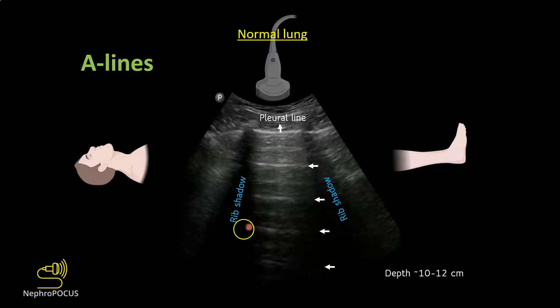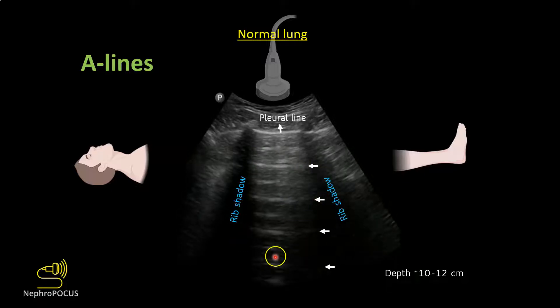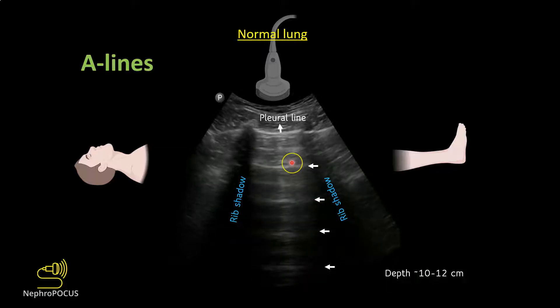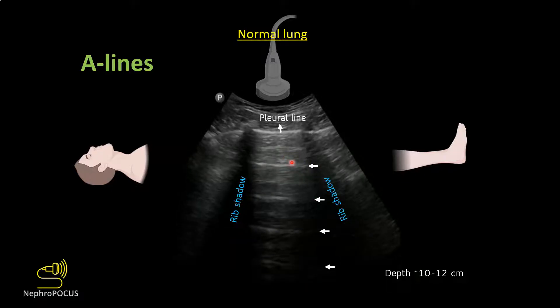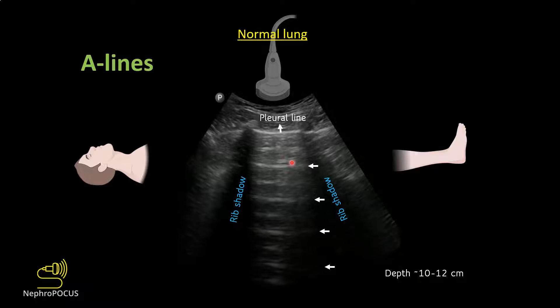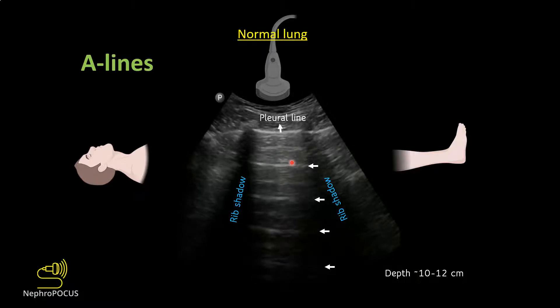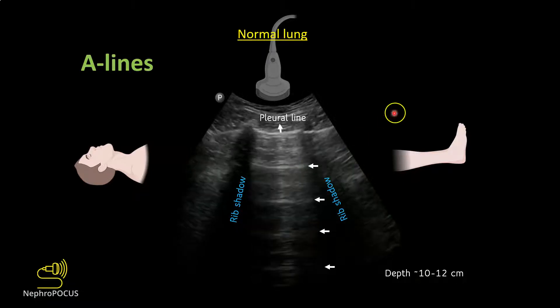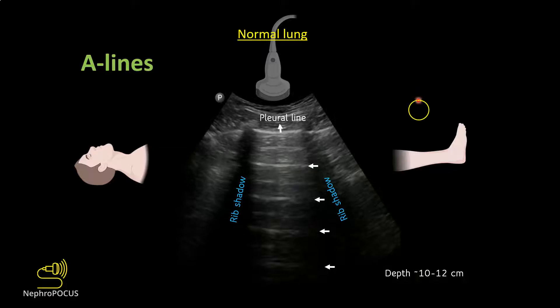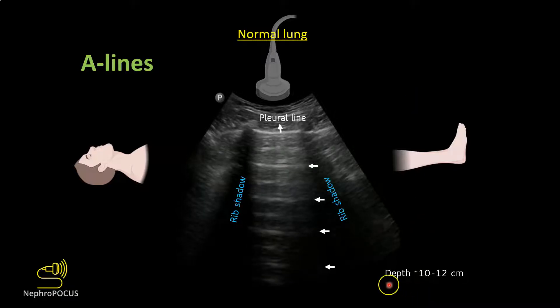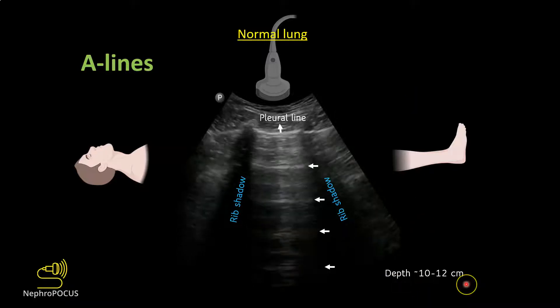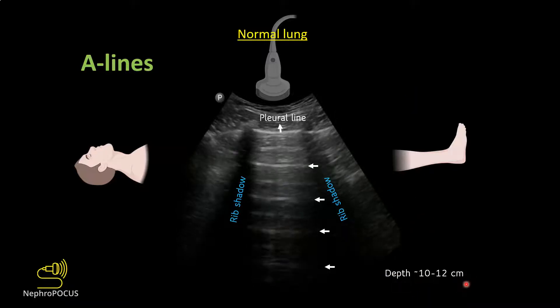These horizontal bright lines, which are essentially reflections of the pleural line, are the A lines. When you see A lines it's normal lung. When you are looking for these artifacts, make sure that you have a depth of at least 10 to 12 centimeters.